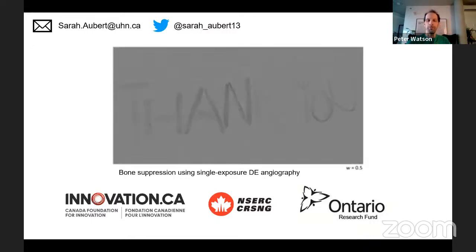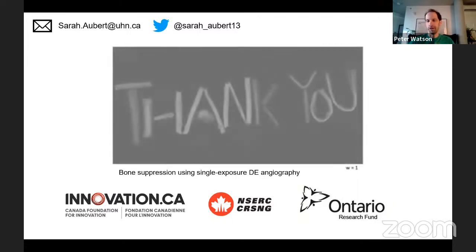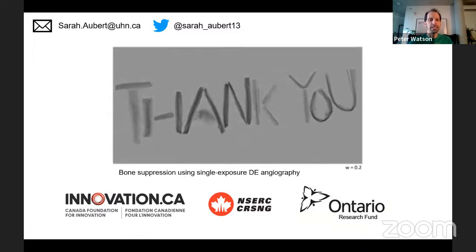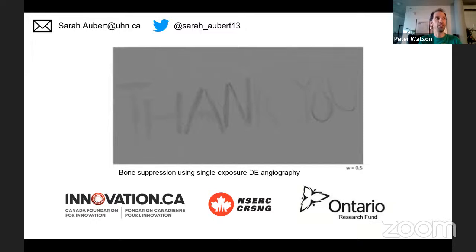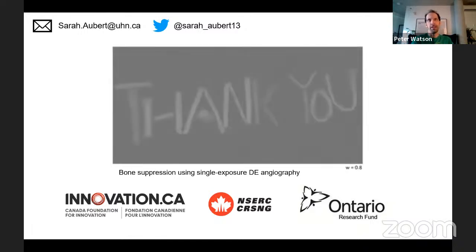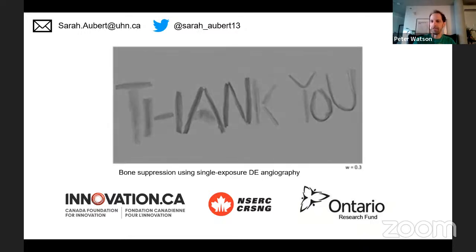So your figure of merit is the SDNR as a function of entrance dose, which is a good figure of merit. Obviously, if you boost the dose, you're going to get better SDNR because the noise is going to go down. But one thing I was thinking is you show the trend with kV and the SDNR keeps on going up, which indicates that if we want better image quality and detectability, we should just be boosting the kV. But I would think if you made the same plot, but instead of entrance dose, you looked at the effective dose to the patient, that would actually reach a maximum and start to decrease.